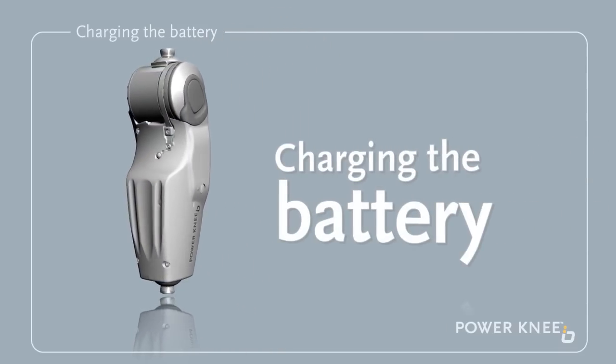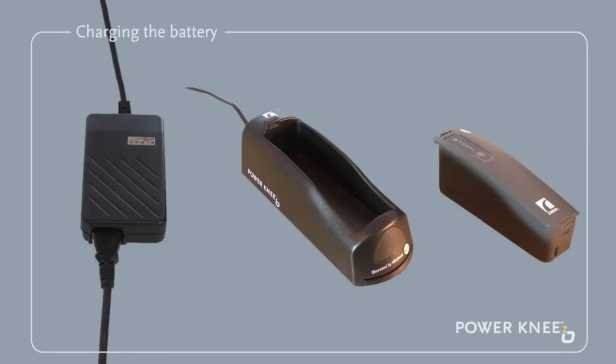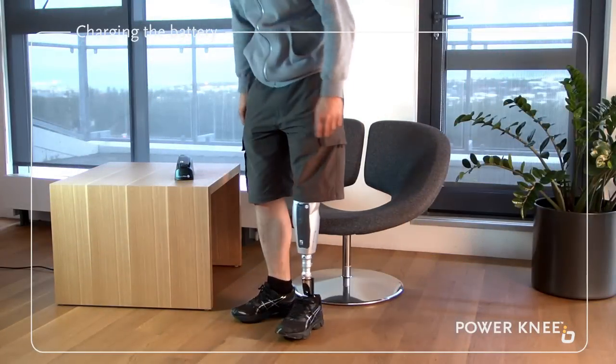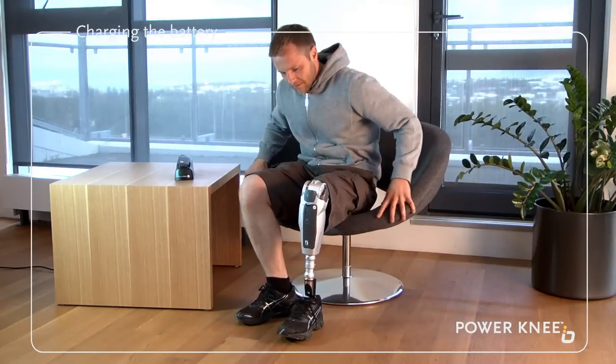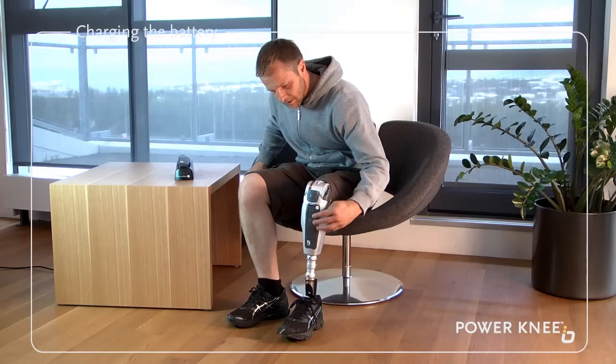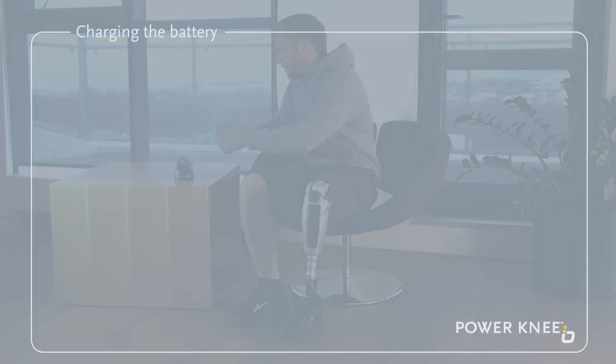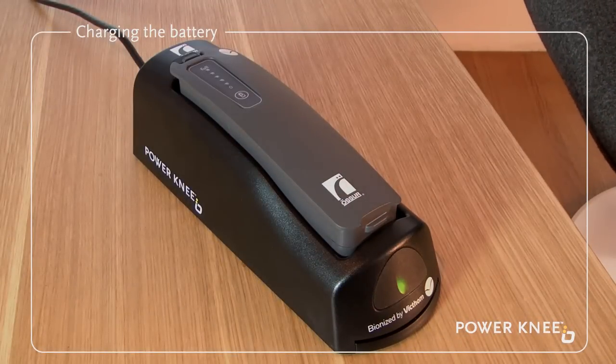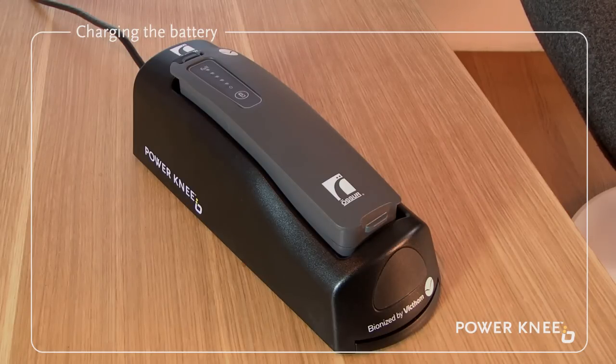Charging the battery. Connect the power supply to the battery charger power inlet. Connect the power supply to an electric socket using the power cord provided. Insert the battery into the battery charger as shown, until a click is heard. While charging the battery, the charger's status light flashes green. Once the battery is fully charged, the charger's status light remains a steady green.